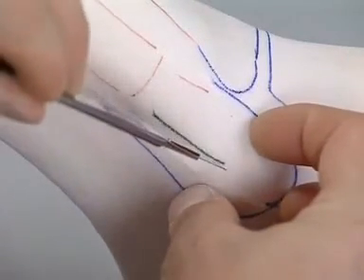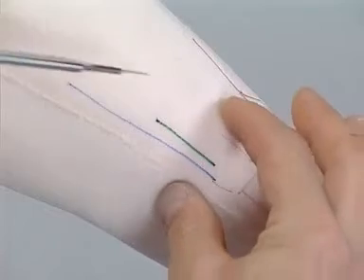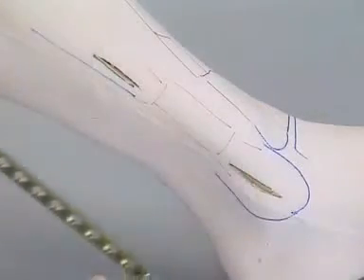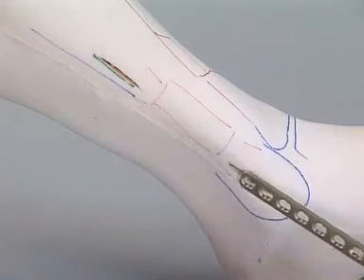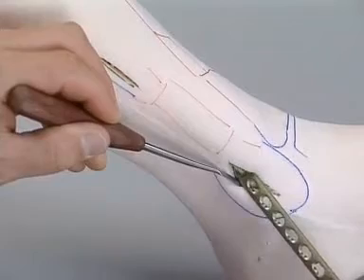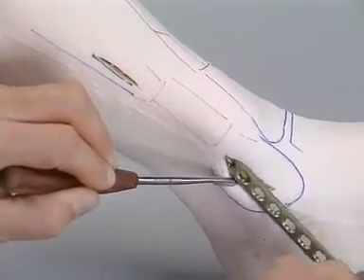The soft tissues are incised at the appropriate sites. If possible, the periosteum is not touched. The selected LCP is again inserted in the distal to cranial direction after previous tunneling of the plate bed. A threaded drill guide again serves to hold the plate.